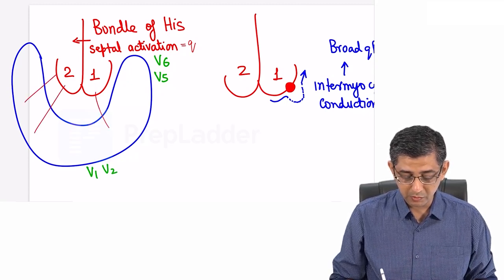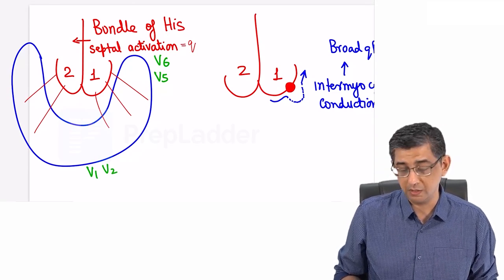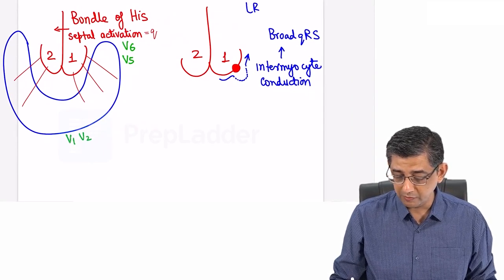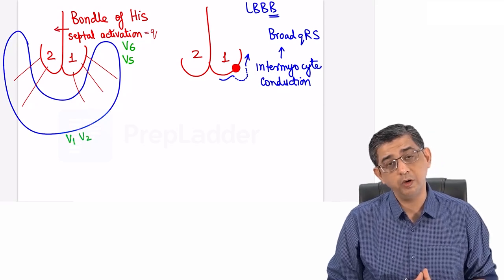These are the Purkinje fibers through which there would be a flow of impulses, and the current will flow from inside to outside, and therefore there would be a ventricular depolarization. The problem in a patient who's suffering from left bundle branch block will be that first you focus on the word block. Block implies that conduction will be relatively slower, and therefore there can be a broad QRS.